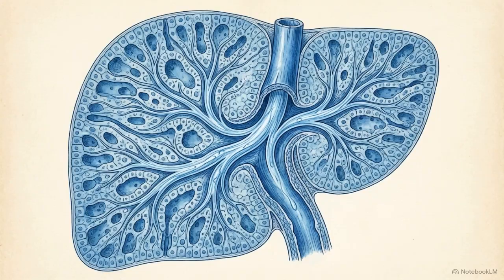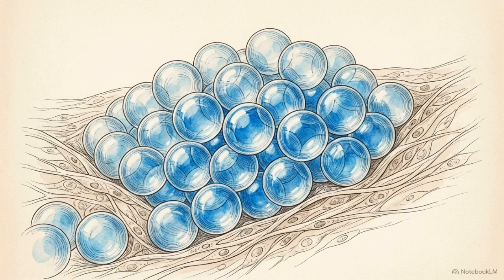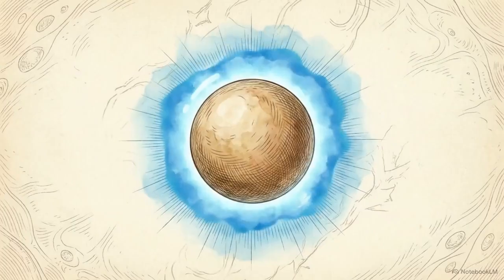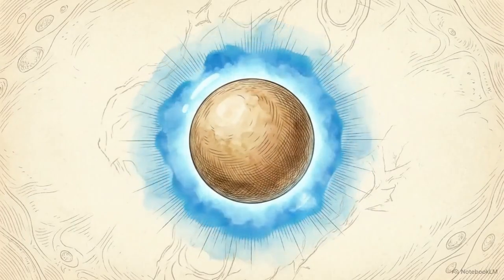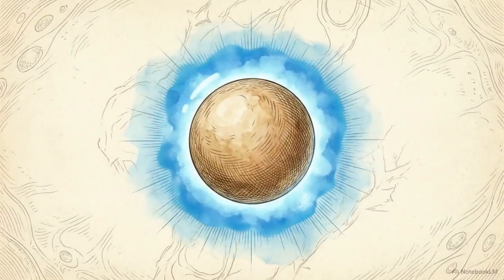For patients with highly advanced tumor burdens, physicians can replace the chemotherapy with a radioactive alternative known as yttrium-90 or Y90 radioembolization. Y90 is a high-energy beta emitter loaded into microscopic beads. Once injected, it delivers 94% of its radiation over a highly concentrated 11-day window. Each microscopic bead emits an expanding radiation field that stops completely at a maximum range of 1.1 centimeters.